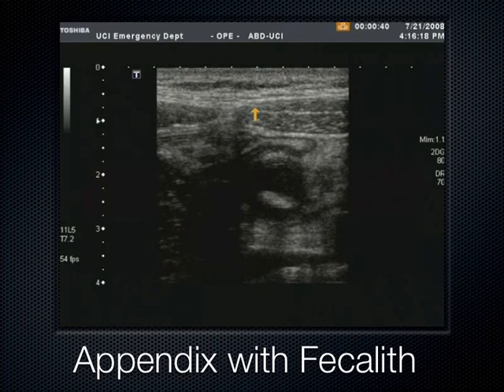That does frighten me, but compressing an appendix, I don't think there's enough extrinsic pressure that you could perforate it. I think really the true perforation comes from the inside getting ready to make it pop. Because yeah, we're pushing a lot of pressure, and maybe I oversold that too much. We're not pushing so hard that we're causing a very local part of it to perforate. I mean, we're pushing enough just to get the muscle bellies to come together.